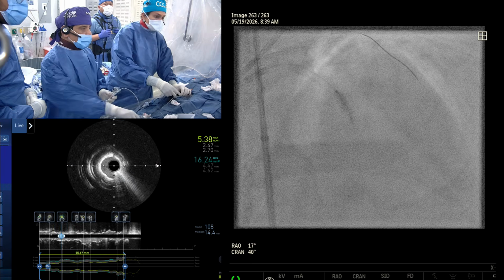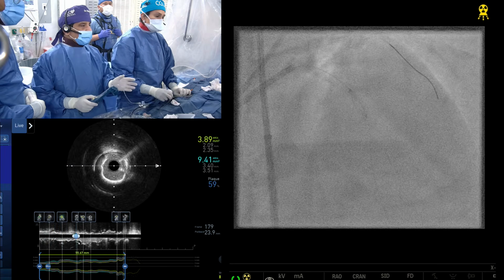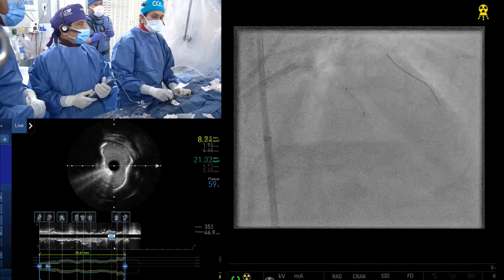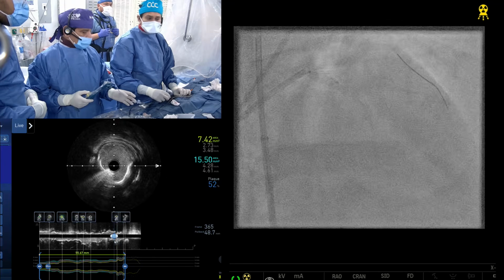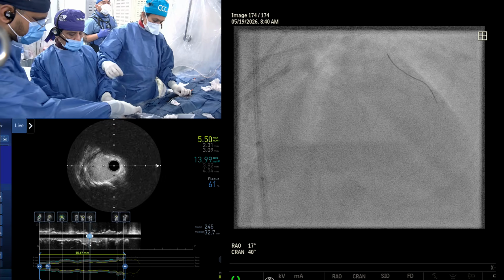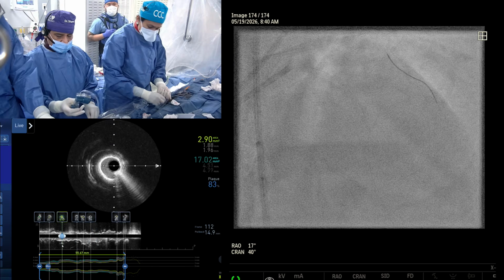That gives you the maximum pulses versus pulses you think like 3 or 4, you think the balloon has expanded and you just limit there. So I'm actually coming out now. Just put it at the ostium again, once again. We've done it. You extracted a lot out of a single device. Okay, let's get the IVUS.